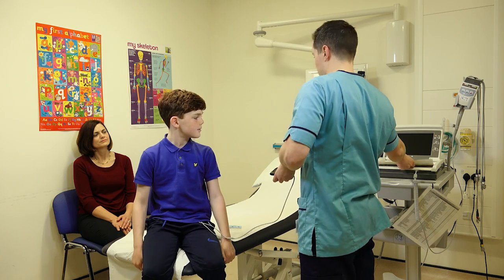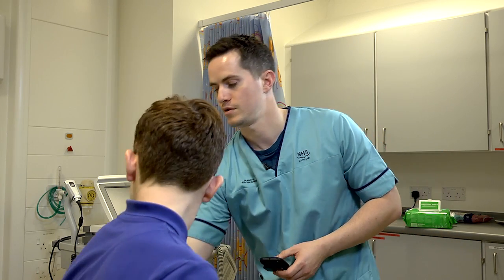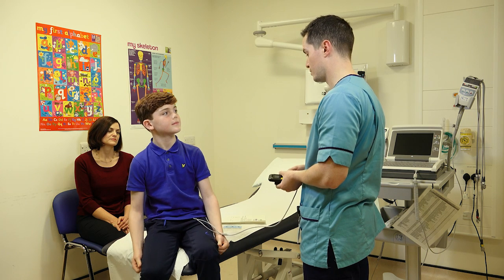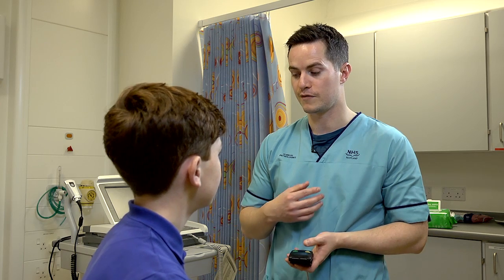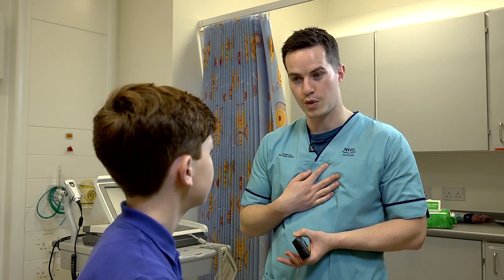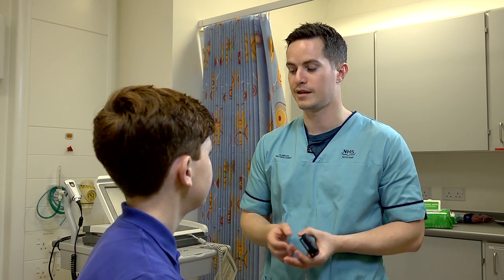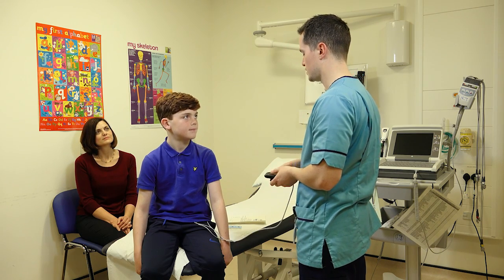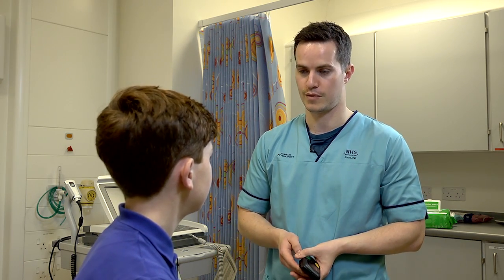I'm going to give your mum a diary. Basically the diary is for you to tell your mum how you're feeling. So while you're wearing this monitor, if you have any symptoms at all, let your mum know. By symptoms, I mean anything like funny heartbeats, feeling sore, lightheaded, or a bit breathless — anything like that. Your mum will write it down in the diary, so when we come to analyse the tape later, we can see how you were feeling while wearing the monitor.